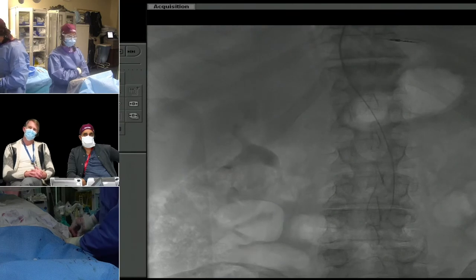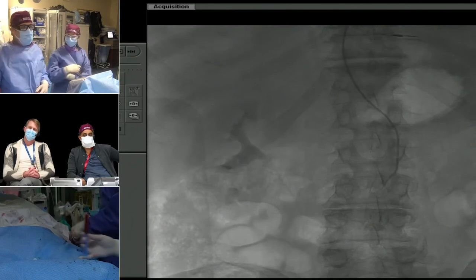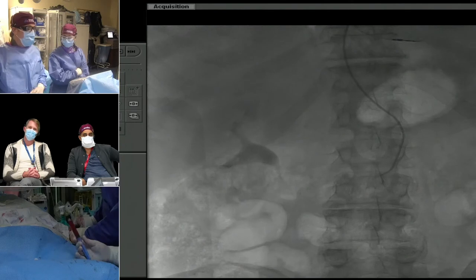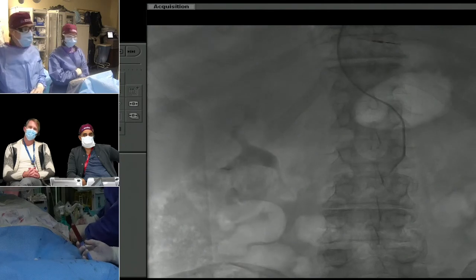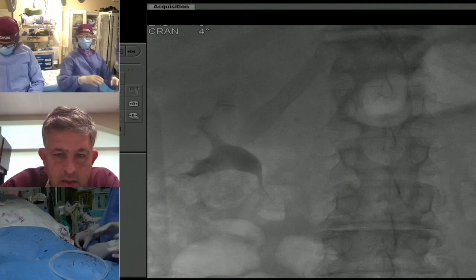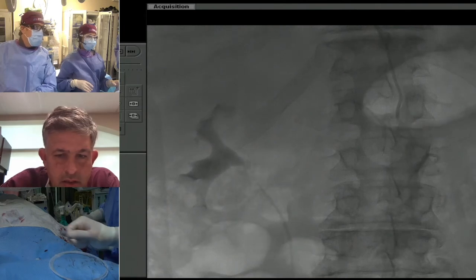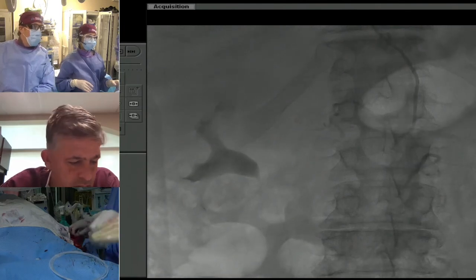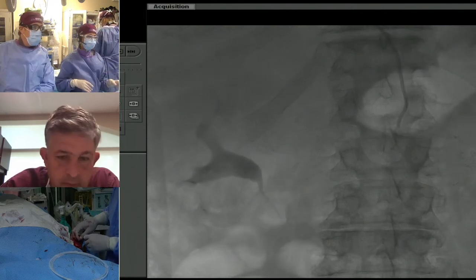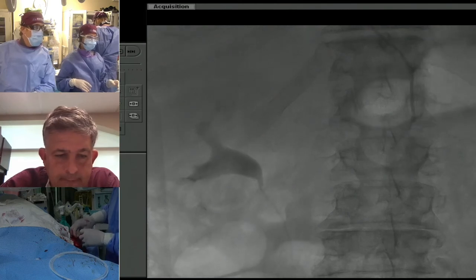I think we're going to have a lot of data on microwave that we didn't have previously. Obviously, we have a fair amount of data on cryo, but I think as you get to these larger lesions, cryo becomes a little more challenging because you need to use multiple probes. In a case like this where the tumor is not particularly hypervascular, do you think there's any role for cone beam? I think there definitely is a role. I tend to find that these RCCs that are not super big usually have just one major feeder.